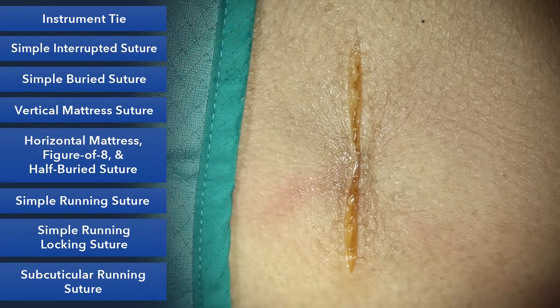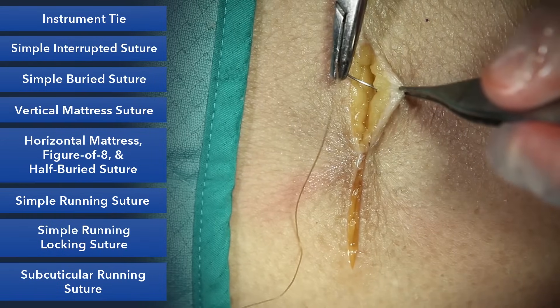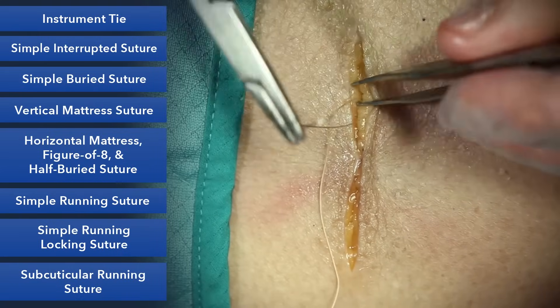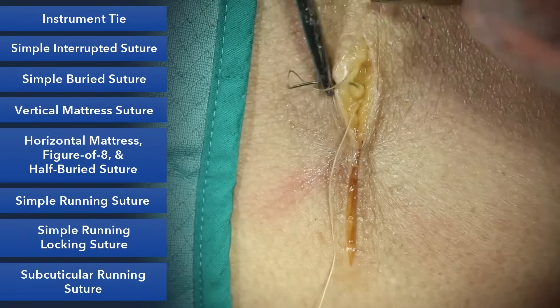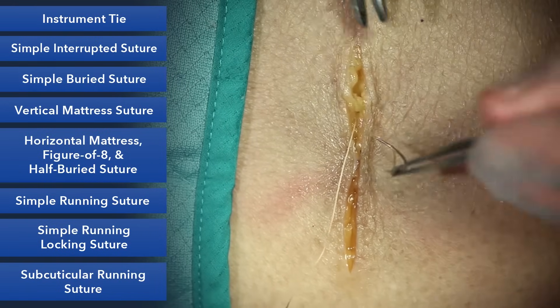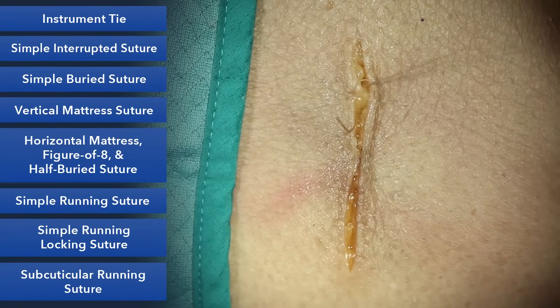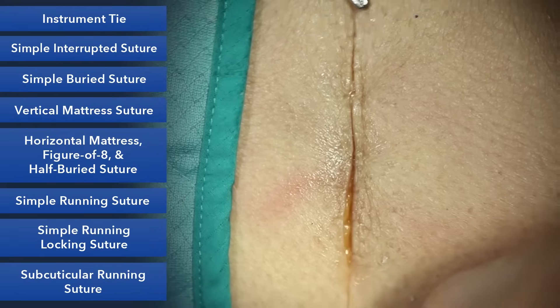Let's go ahead and do one more. You're going to go from deep to superficial without button-holing the skin, then from superficial to deep. Make sure you're coming out on the same side of the loop. We'll do our instrument tie and pull it along the length of the wound so it'll allow it to bury.